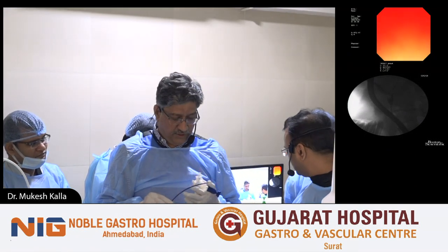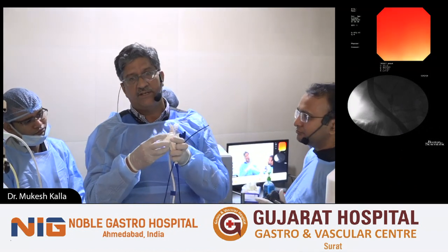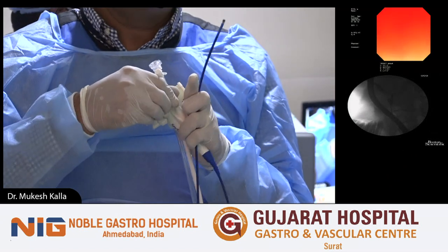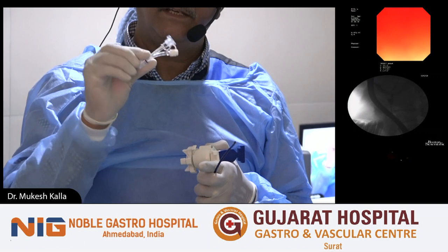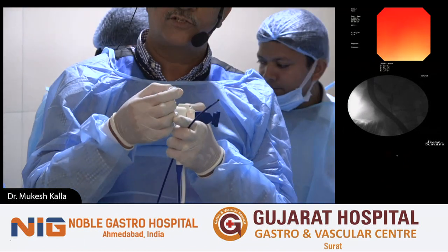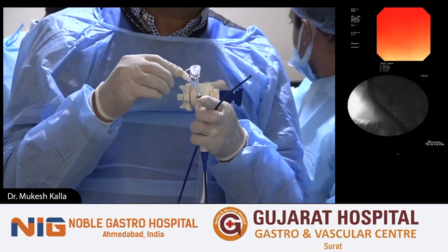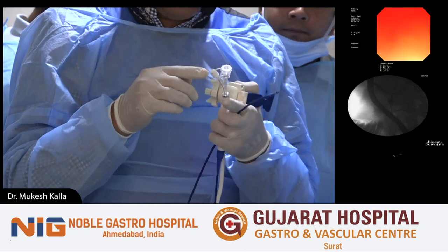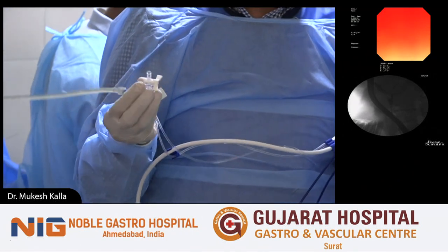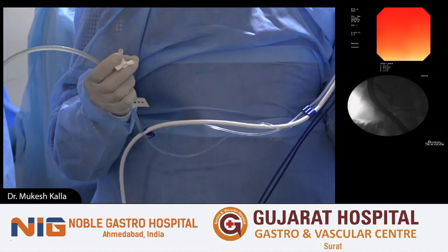So this is the cholangioscope. This is a 260 centimeter long catheter, and it has up, down and right, left movement. It has a working channel which is 1.2 millimeters in size, and the company provides us with a three-way cannula, this three-way adapter, so we'll fix this adapter here. There is a screw here; we will push our laser fiber or EHL fiber through this port and fix it there, and this port can be utilized for aspiration or suction. And then these are the knobs. Beyond this, there are two small tubes which are provided. We have to understand that whether you are using EHL or laser lithotripsy, there is heat generation near the stone.